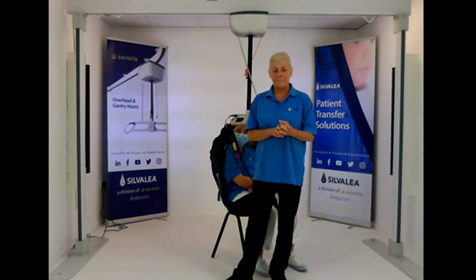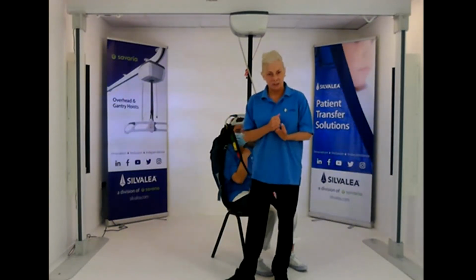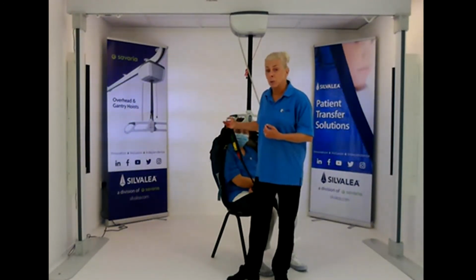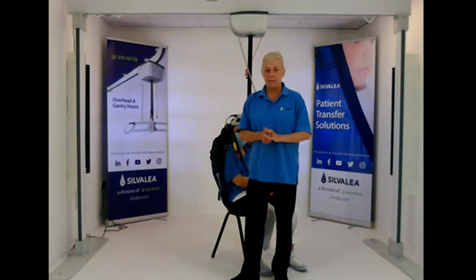And the other question: do you have a moving and handling risk assessment that includes the use of the straps, etc., that we can fill in and pass on to carers? Okay, the moving and handling risk assessment needs to be done by a healthcare professional. So whoever's doing the risk assessment and the care plan will have to determine that. They will look at the options, the style, the fabric choices, suitability for the transfers, the pickup positionings, saying which colour coding is required for this person and this transfer. So it's a care plan done by a healthcare professional.